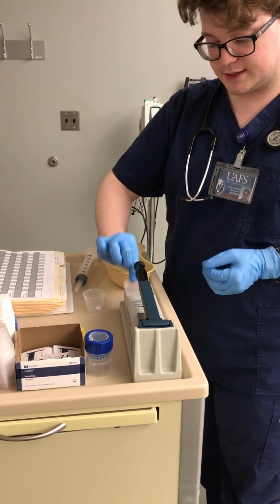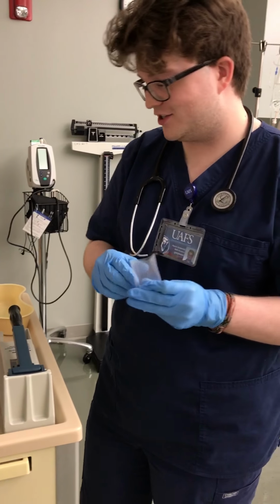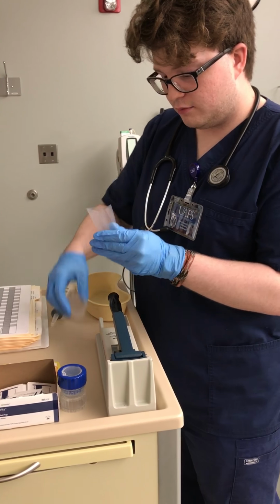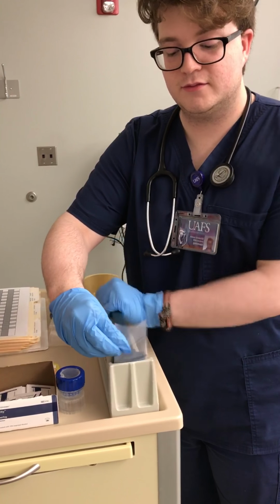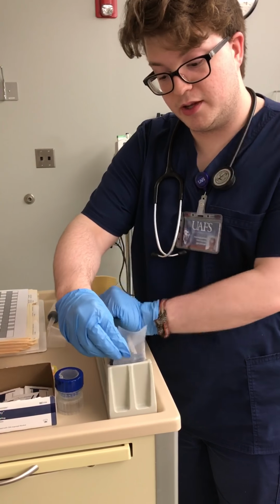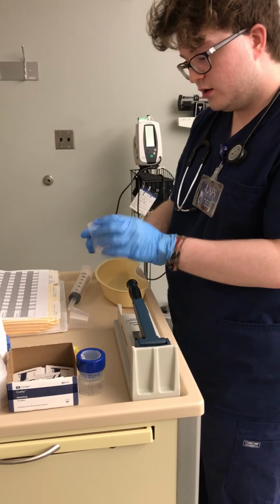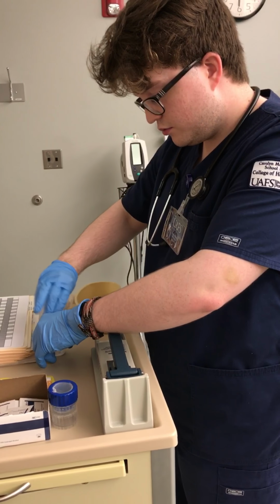and since acetaminophen can be crushed, you have to crush the medications for the NG tube because you can't get a pill down that. So I put it in this little baggie. Crush it real good. These are really thick pills. Okay, I think I got it. So I'm gonna open this up a little bit. Pour it into my cup.